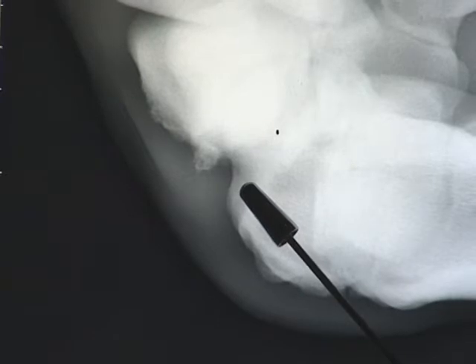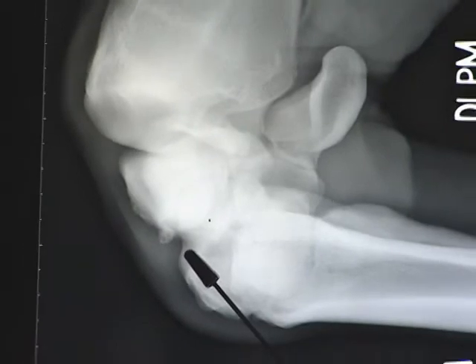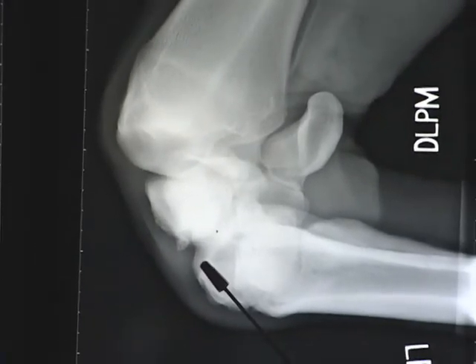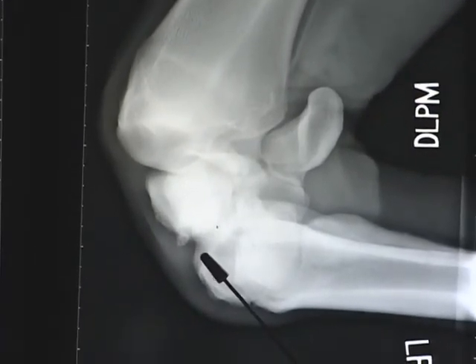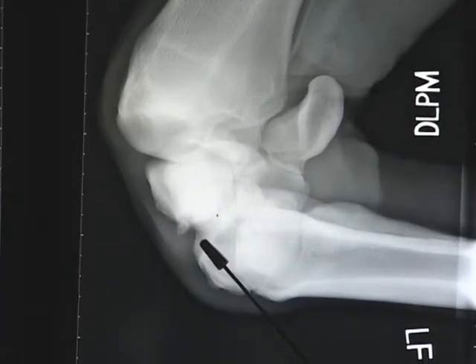So this is the radiograph that shows the knee flexed, then fully flexed. This is the radiograph that shows the knee fully flexed. It's from an angle. This is an oblique view. And this is picking up this problem we have in the joint here that's going to at least show us what our diagnosis is. We've got an osteophyte.